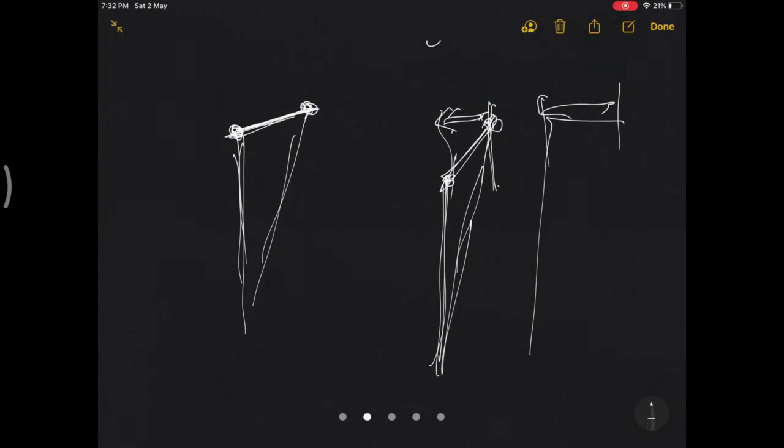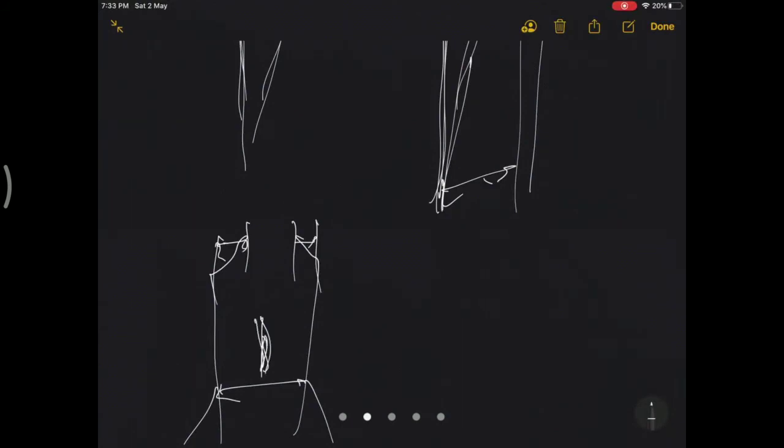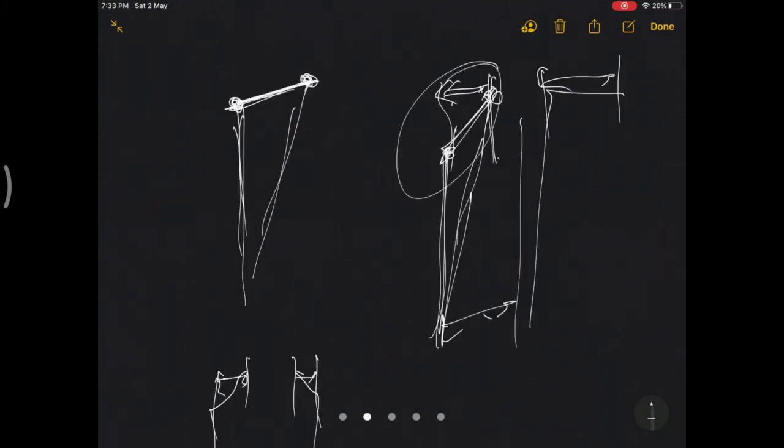One thing is that in a coxa valga, both feet are almost near each other because of the less horizontal offset. On top of that, if you make the same 7-degree valgus and knock knee, they will start rubbing the medial aspect of the thigh, which is not acceptable. So if you have a coxa valga, you will take a less valgus cut.